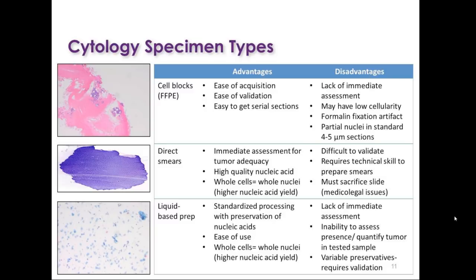Liquid-based cytology is being increasingly used for not just diagnosis, but for molecular testing, because these are collected in a special media which has standardized processing. So you have good preservation of your nucleic acid. They're easy to use because you can transport these at room temperature. And again, like the smears, you're utilizing whole cells, so you get the entire nucleic acid content from the nuclei.